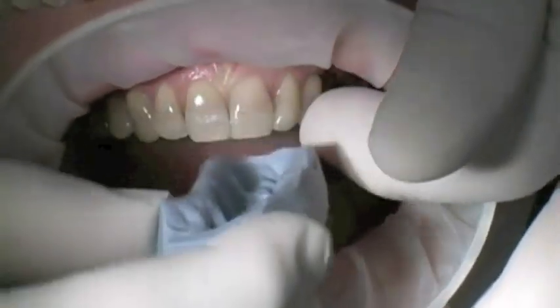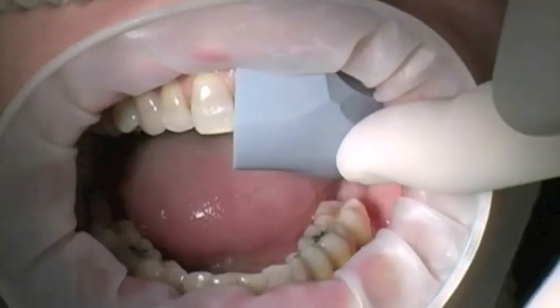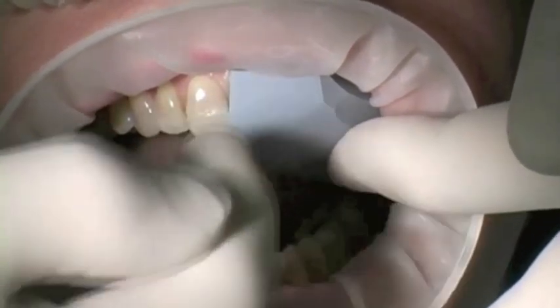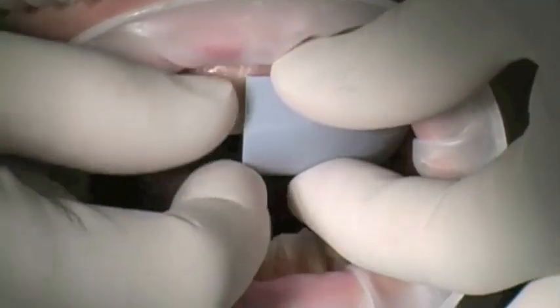What we're going to do is get her to open up a little bit for me — open a little bit bigger. And then we're going to just seat this in here. You see that I haven't cut it — it completely covers tooth number 9. Well, I'm going to start on tooth number 9, and then we'll progressively cut this as we move on around. So the first thing I'm going to do is section the index.